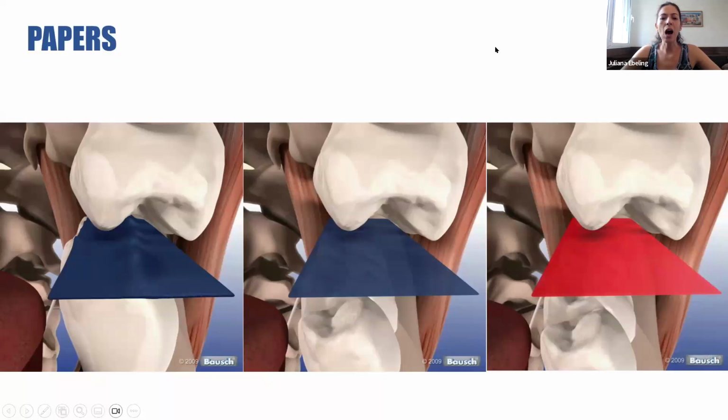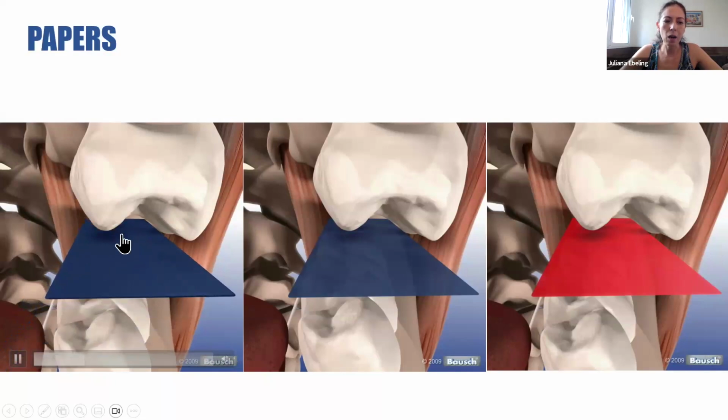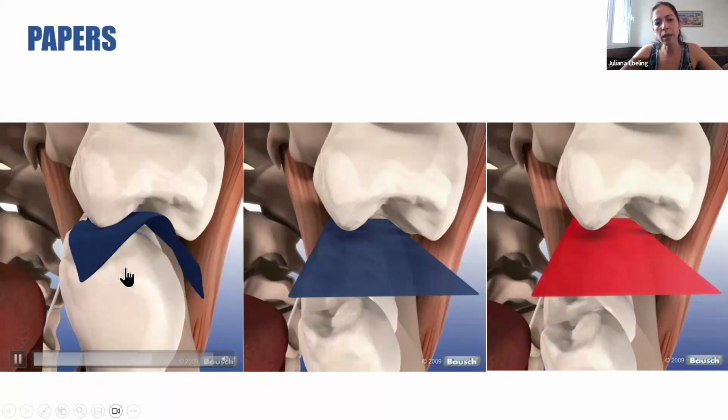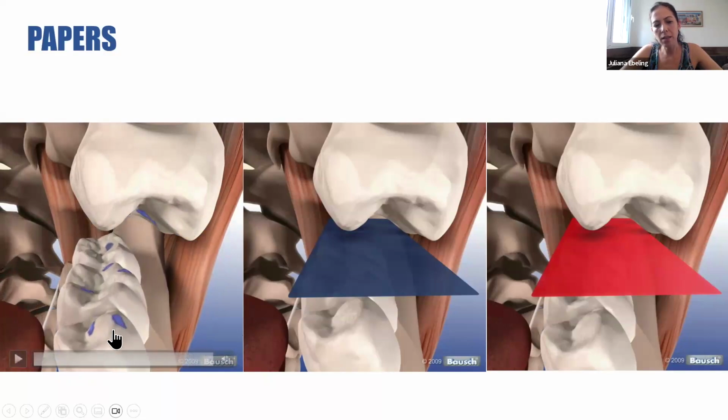And let's understand how we were trained. We were trained to use and to check the occlusal contacts with papers. And how do papers work? Let's understand. This is a 200 micrometer paper that models the occlusal anatomy and leaves a surface marked where we have contact. Look at this surface, it's large because the paper is thicker, and we have this paper from Bausch.